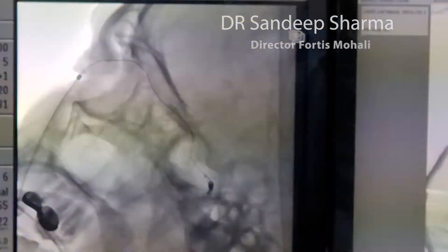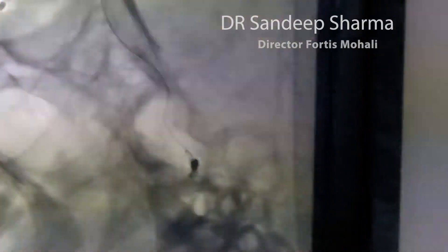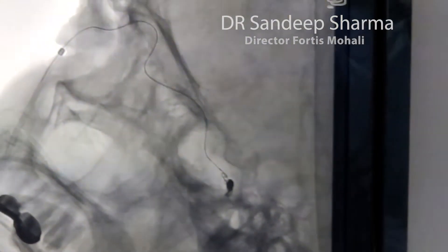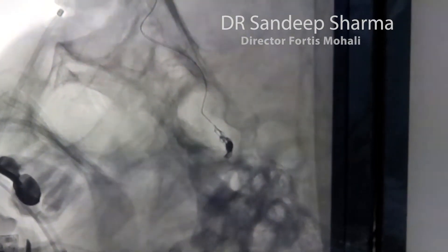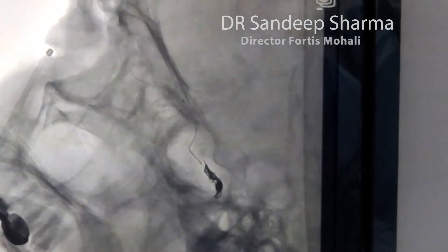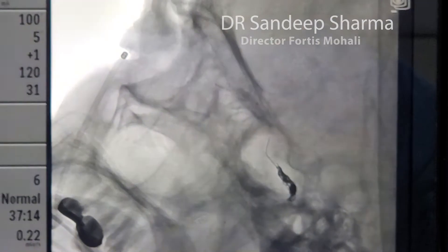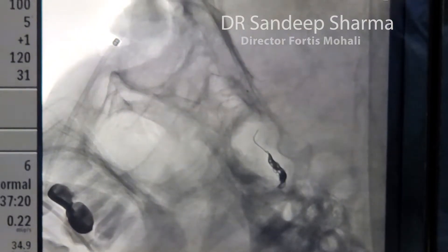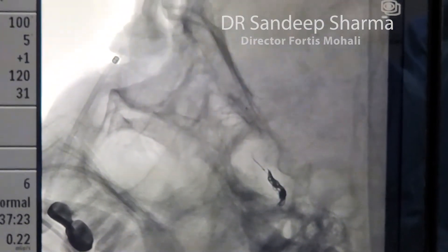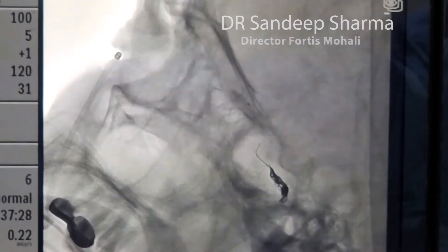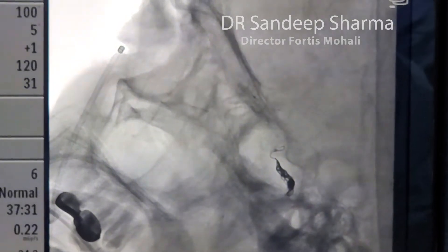That's where the vein started filling. Starting from the first coil, loops are taking shape there. Just trying to bring it a little back — it's a flaccid vein, so it has a tendency to come back. Filling it nicely with a longish coil. This is the last bit — this is the chamber here, the most spacious area. The catheter is jumping and moving; just take some time.